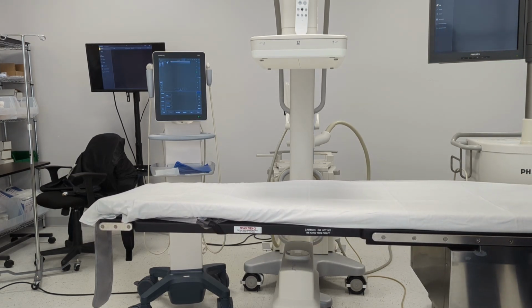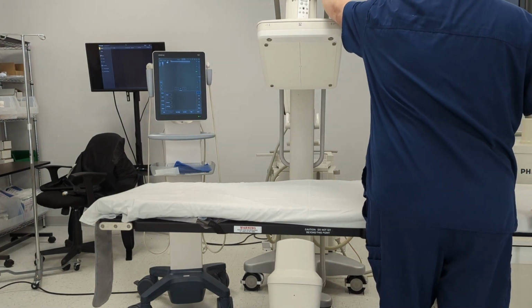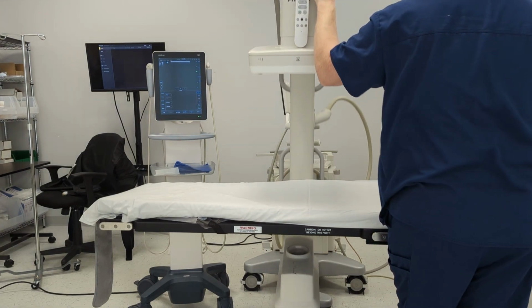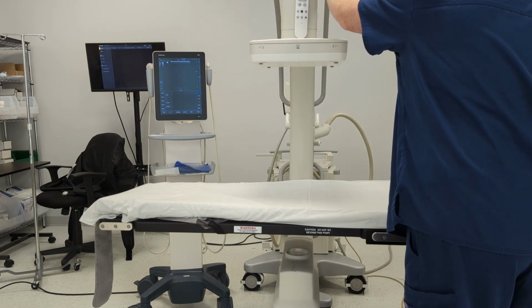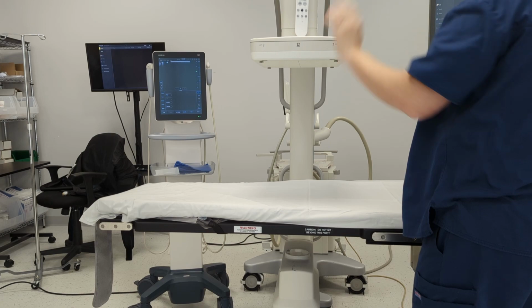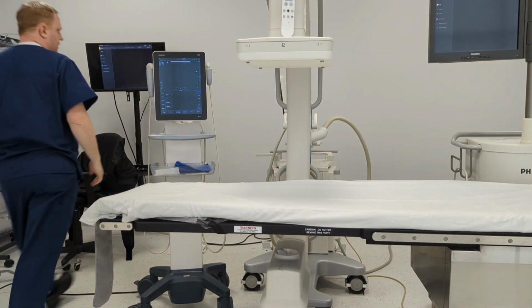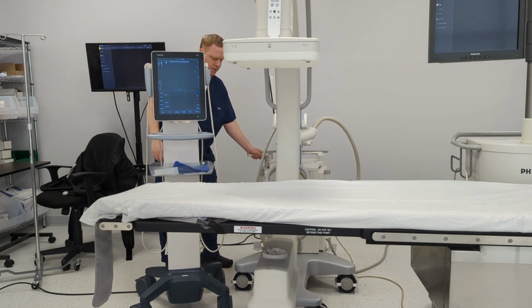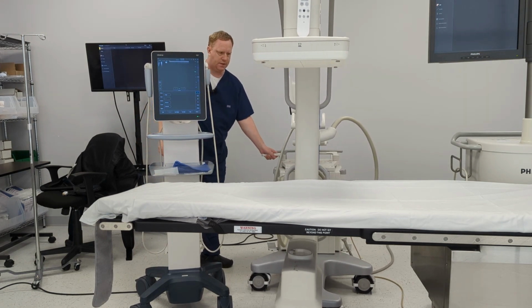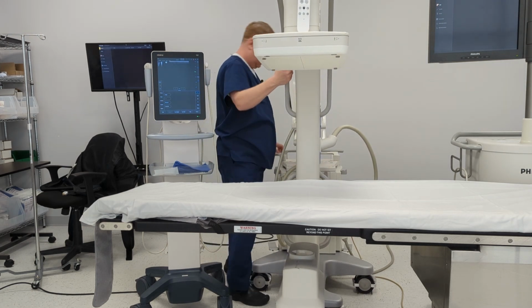For most of our cases, we end up doing the panning side to side, so we can reach up and pivot the camera. If we do need to move up and down the body, we can also use the wheels of the C-arm, which I'll show you in a minute. Typically, this isn't needed because we have enough room on our table and the table has plenty of travel.